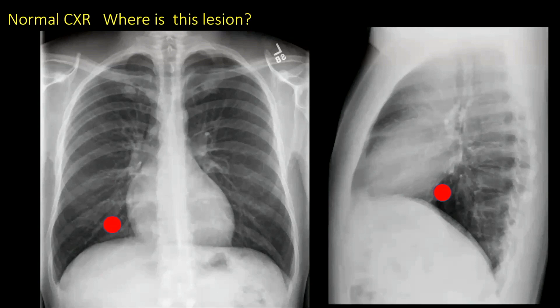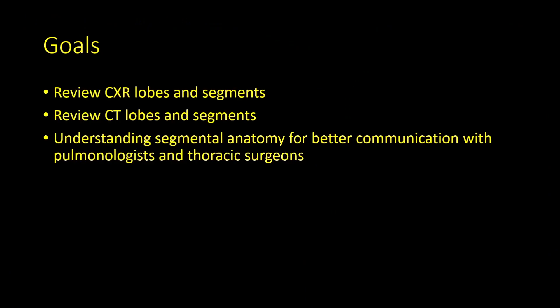Hopefully by the end of the talk, you'll be able to go over the chest radiograph here and tell your thoracic surgery or pulmonary colleagues exactly which lobe and which segment a lesion is in. The goals will be to review the lobes and segments on CT and chest x-ray so you have a better understanding and a better way to communicate with your colleagues.